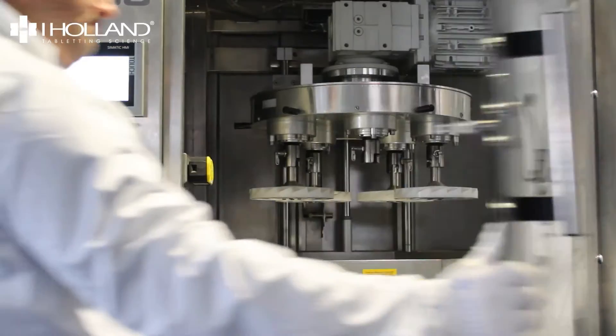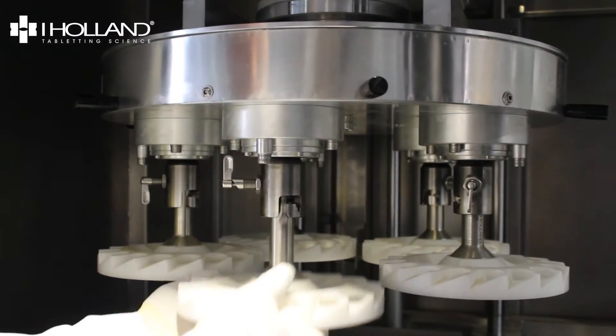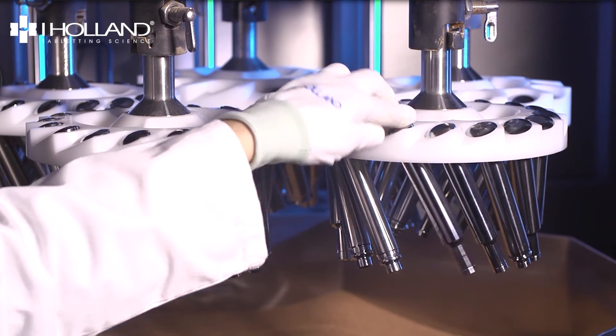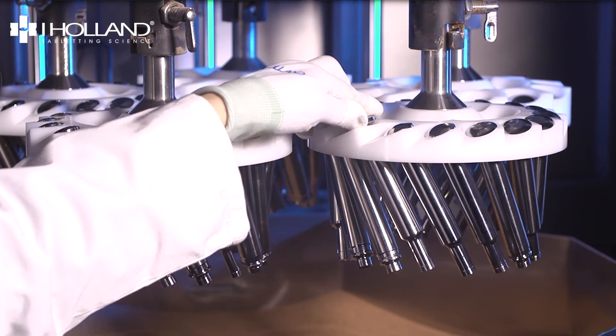To load the carrier, lift the plunger and push the holder up. Twist it into the final locking position. Now we can load the tools. Be careful at this stage not to knock the punch tips against the holder. Specialized carriers are also provided for dies.